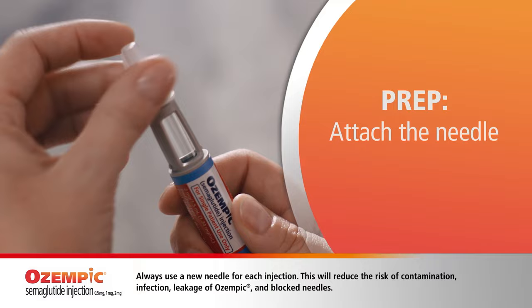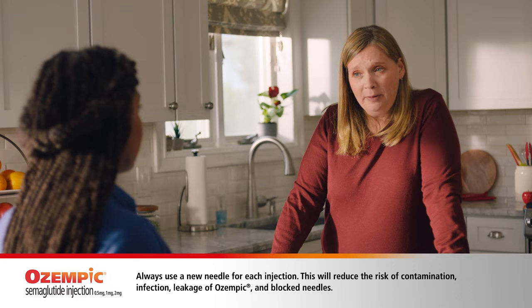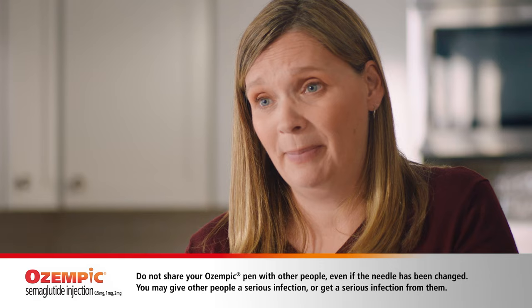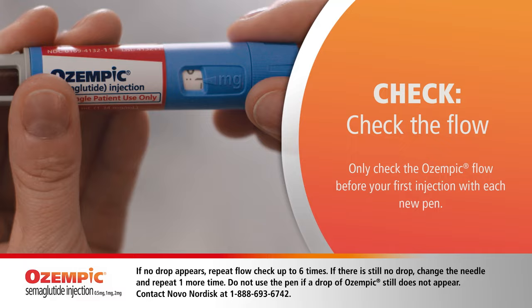Next, I put on a needle. Just pull off the paper tab, push it, and turn till it is on tight. Pull off the outer cap and then the inner cap. Make sure that Sam always remembers to use a new needle after each injection. He also shouldn't share needles or his Ozempic pen with others, or reuse the needles, because of the risk of serious infection.